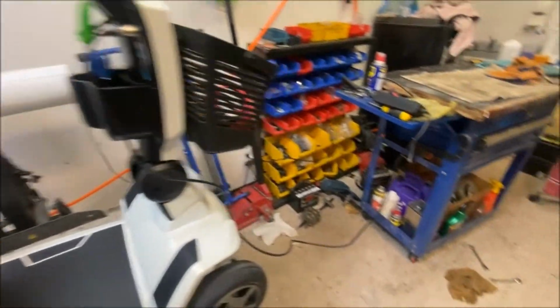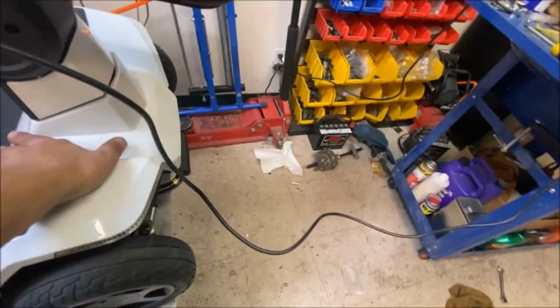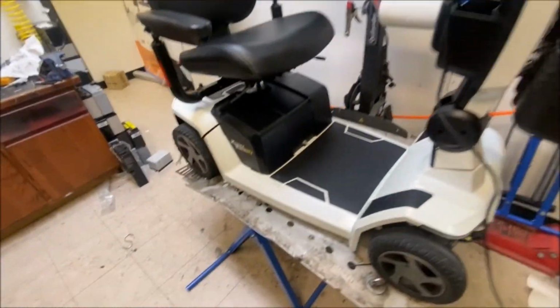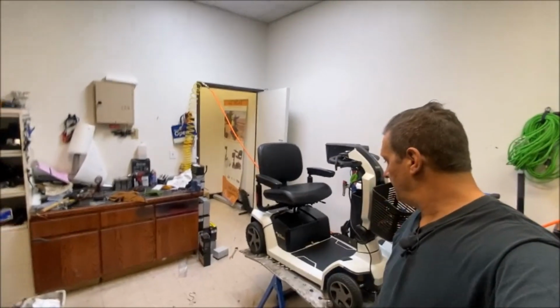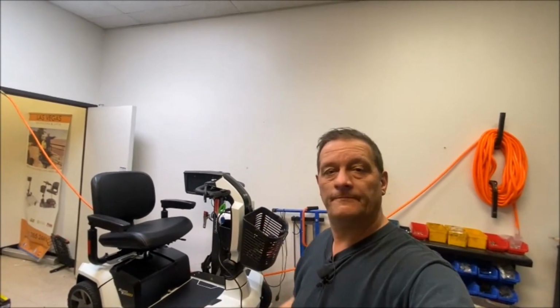Just got it on charge now, just to make sure the charger works. Put it on charge so they've got a full charge ready for the morning when I pick it up. And that's all done. Yeah, big boy. Not the easiest scooters to service, but they can be done. Just a matter of checking everything, Loctite on it, done.